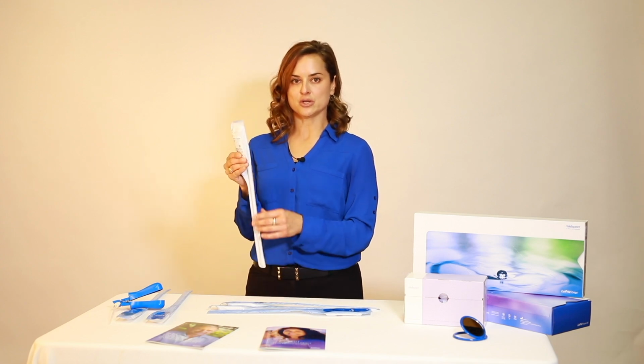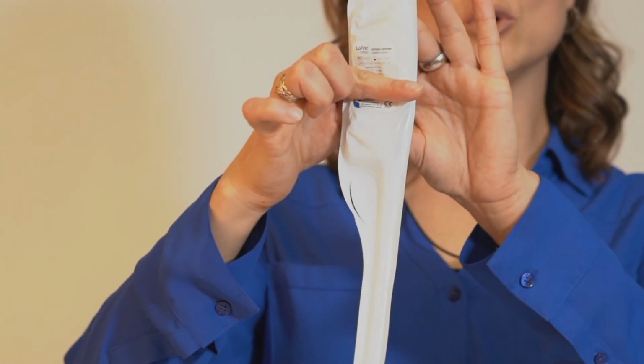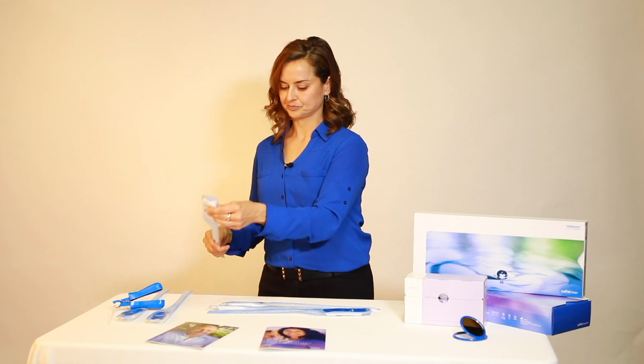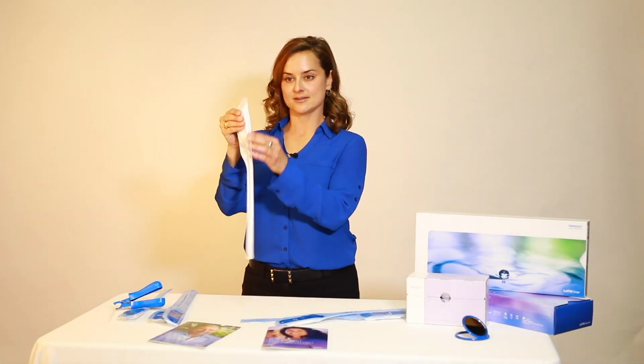Okay, so the next method I would like to show you is by feeling for where that salt solution sachet is and putting your finger right in the center and perpendicular to the sachet, and then folding the salt solution packet over so you're creating pressure and getting the sachet to release inside. And then lastly, if you have limited hand dexterity, you could always use a hard countertop. Put the catheter down on a table or a countertop, and use your elbow to push down on the saline packet to get it to release. And that is one other way that you can release the sachet to then activate or lubricate the LoFric Origo catheters.